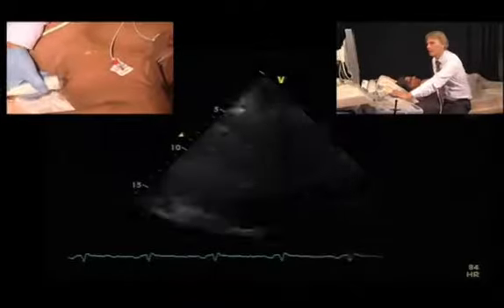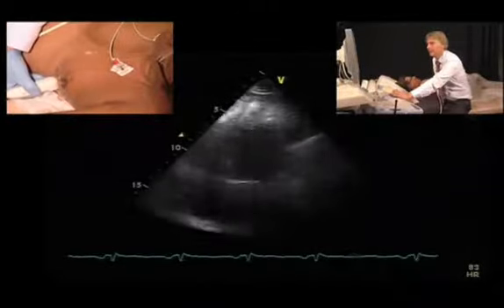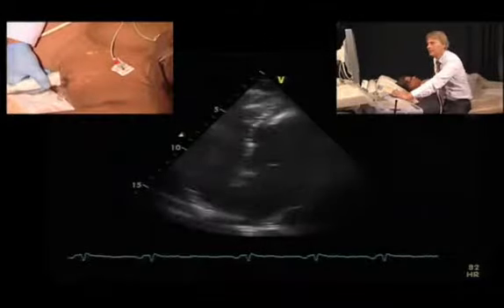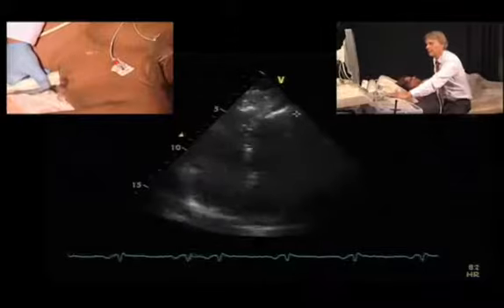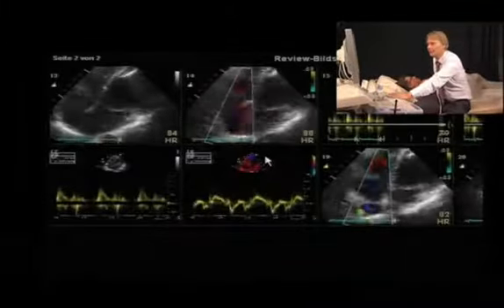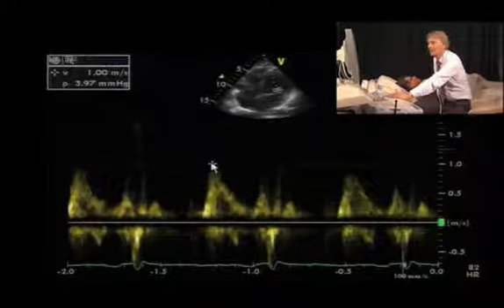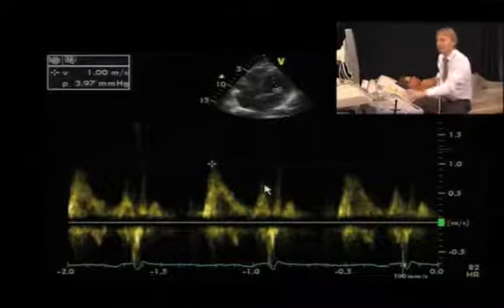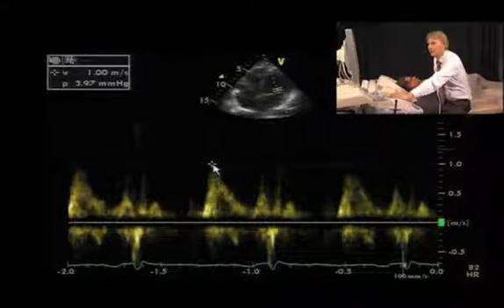First, we will have to look at the Doppler spectrum across the mitral valve, which is not easy in this patient simply because he has shadowing of the mitral valve due to the infiltrates that you see up here. So I will show you the pre-recorded Doppler spectrum. And what we see is an E wave which is taller than the A wave. And the question now arises, is this normal function or does the patient have pseudonormal function?